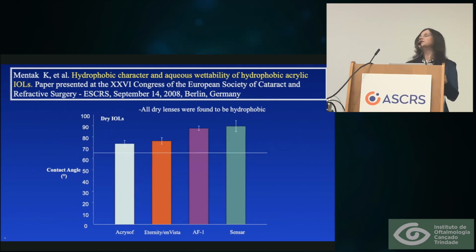And what was very interesting is that in the dry state, all of the lenses are really hydrophobic. So you can see there in the graph that the contact angle is quite high. The line actually represents the contact angle for the PMMA material, which is also a hydrophobic acrylic material. So all the lenses hydrophobic.